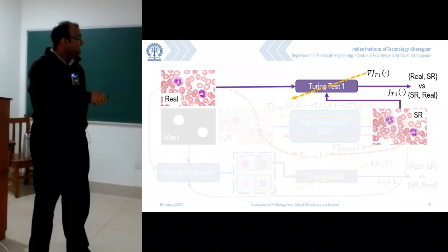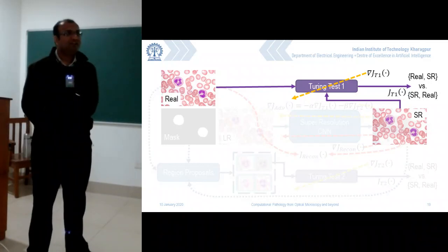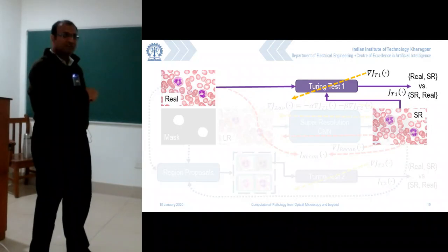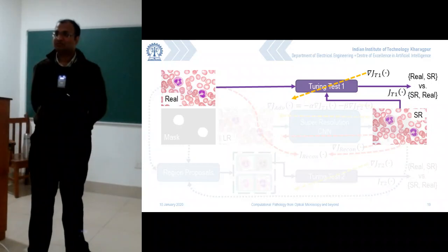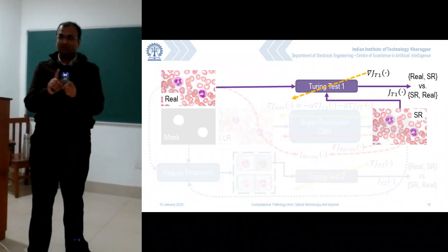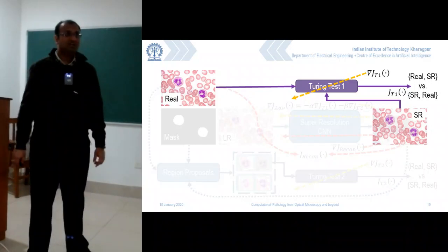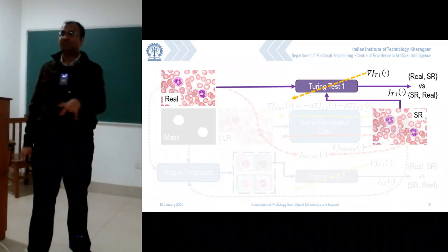So now we did a similar thing over here. We said we will impose the most complicated test for our machine learning. I will give you two images: this is generated, this is originally present, and this is a super-resolution image which comes from my CNN, which is my machine generating that. And I ask this machine, I give you a pair of images, you tell me whether it is real or not real. But then we played something called a relativistic test, which is the same as trying to play spot the difference puzzles.